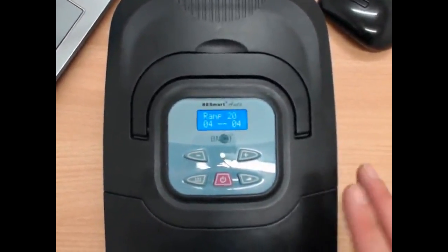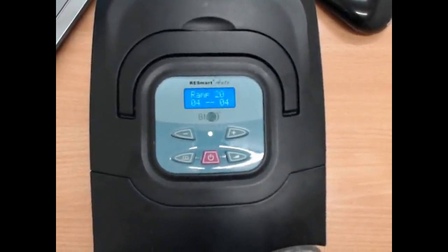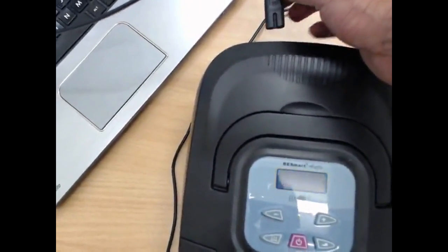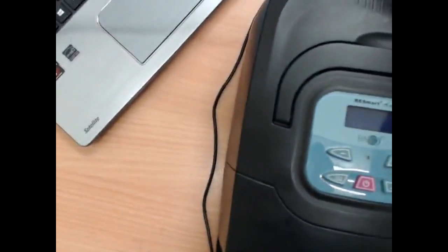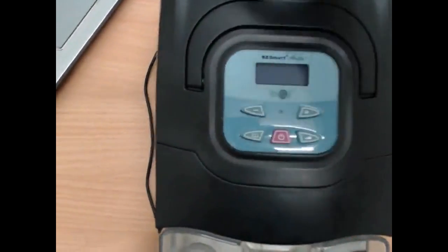So that's pretty basic. That's your basic patient settings. To get into clinical settings, there's a bit of a trick to it. Basically, you need to have the power out, and what you want to do is hold down these 2 buttons while reinserting the power. So you hold down these 2 buttons, and as you're holding them down, you put in the power.